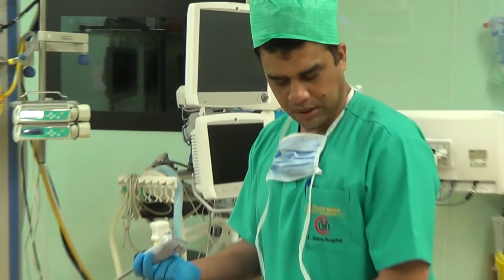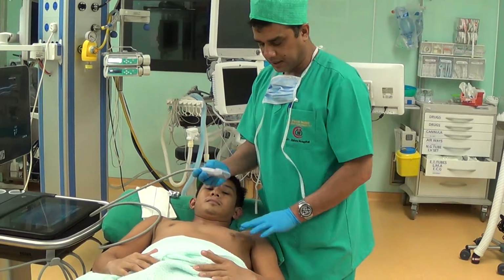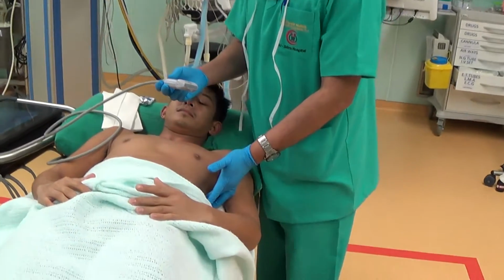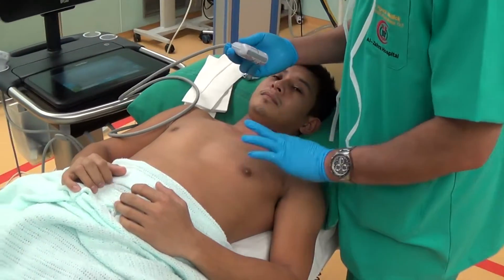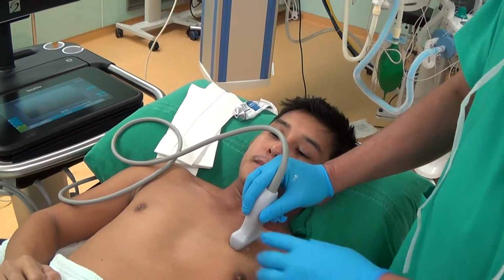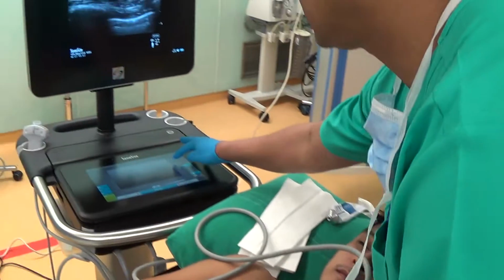Two areas in the mid-clavicular line, one here and one towards the base of the lung. So three areas on this side, three areas on this side. This is for the total lung examination. What we are going to see here is the lung sliding sign.